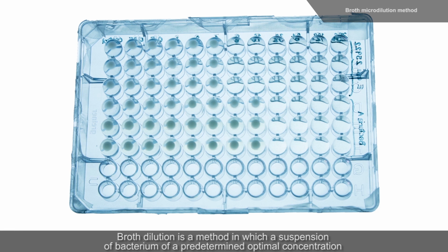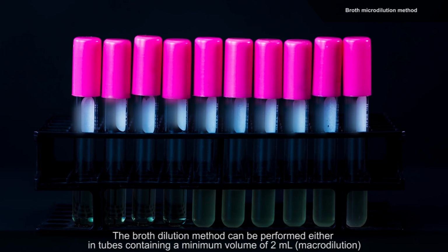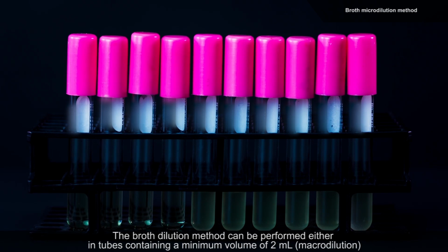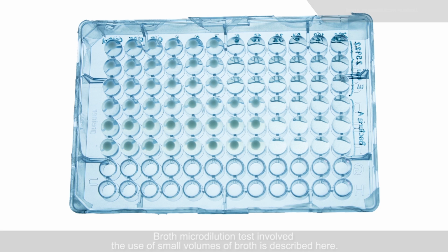Broth dilution is a method in which a suspension of bacterium of a predetermined optimal concentration is tested against varying concentrations of an antimicrobial agent that is usually serial twofold diluted. It aims to determine MIC. The broth dilution method can be performed either in tubes containing a minimum volume of 2 milliliters or in smaller volumes using microtiter plates. The broth microdilution test, which involves the use of small volumes of broth, is described here.